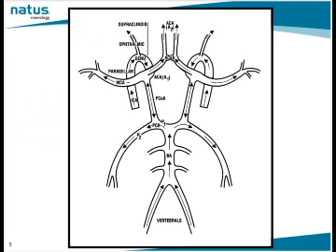So let's start with an understanding of the basics. Anybody trying to do a TCD exam needs to be familiar with the flow direction of each artery. Every artery has a known flow direction, and you need to know the expected normal depth to find those arteries, and that's what's illustrated in this slide here.